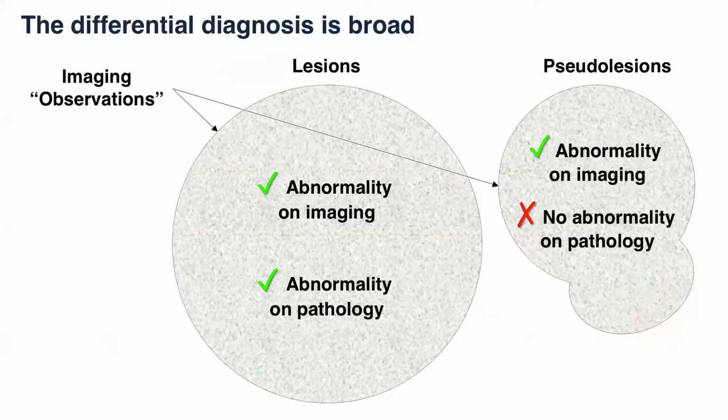Because we sometimes don't know whether something's a real lesion or a pseudo lesion. See, if we always knew, then it'd be easier. We just call them either lesions or pseudo lesions. But because we don't always know, LI-RADS likes the term observation to describe globally something we see, and we're not sure whether it's a lesion or a pseudo lesion.